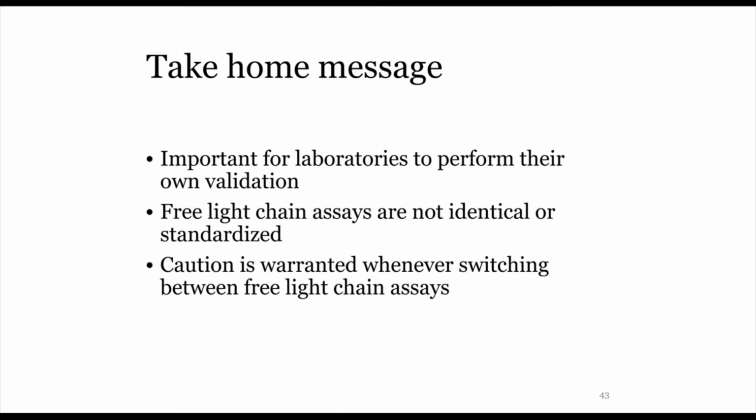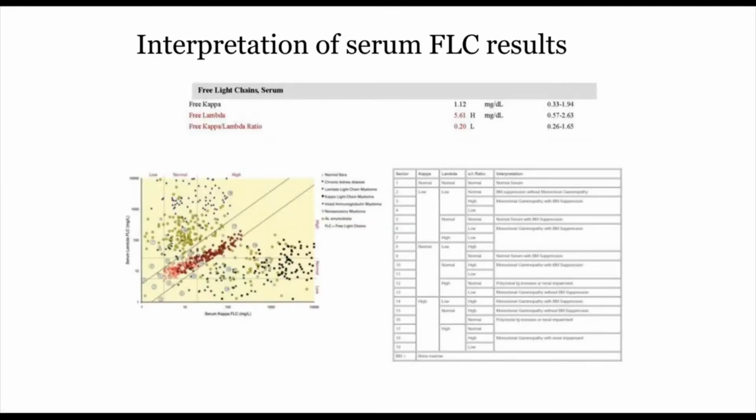Now, with the Diazyme assay, they don't have a lot of the studies behind it. And so I think if people want to use this assay, there needs to be another, larger study to establish what that ratio is going to be for that particular assay. I know the Diazyme assay was FDA cleared using, I believe, the 510(k) equivalence mechanism, but it didn't undergo as much of the, it's not quite equivalent to the Binding Site. And so people who want to use that assay are going to need to do their own study involving hundreds, thousands of normal donors and patients to establish a range that falls into the diagnostic area. And that's separate from the other potential antigen excess issues that we have encountered.